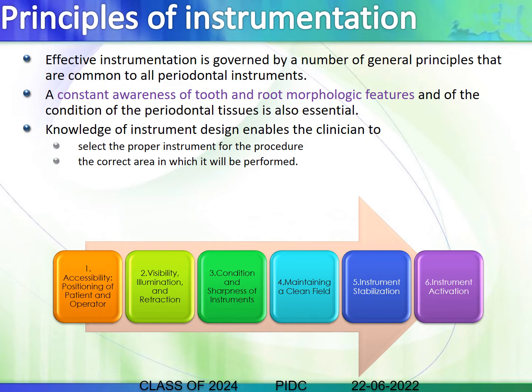So these are the 6 principles of instrumentation as shown below. We will go through each of them, and it's always better that you follow the same sequence.